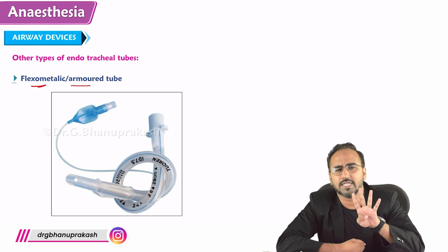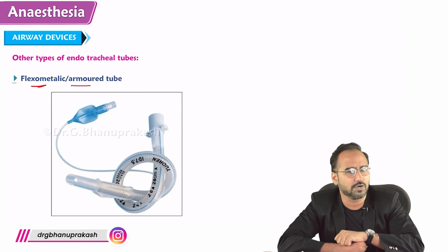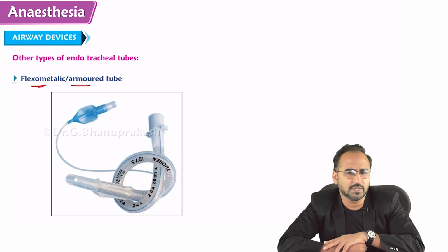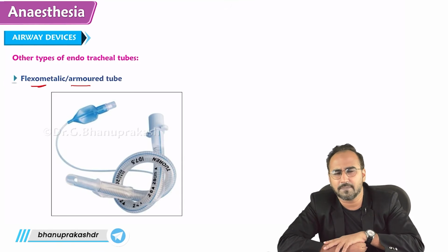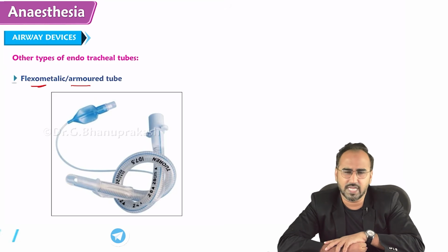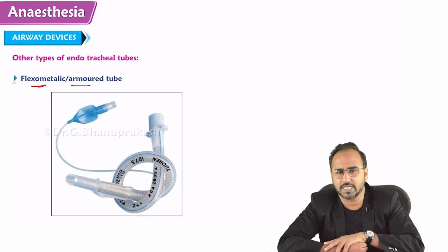General anesthesia is given in 4 phases. The first phase is pre-oxygenation, second is induction, third is maintenance, and fourth is reversal. First is pre-oxygenation: I gave some oxygen to the patient. After giving oxygen, I went into the induction phase.